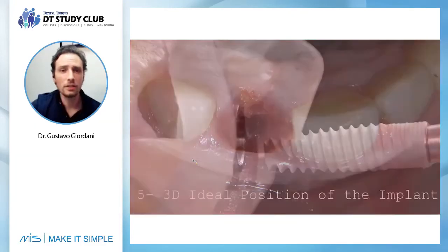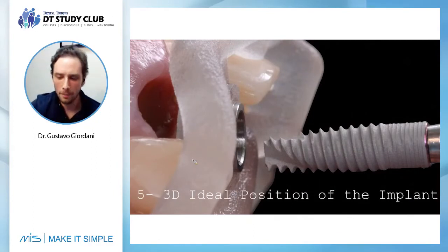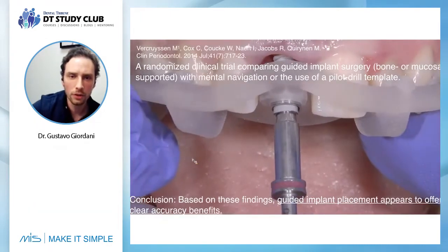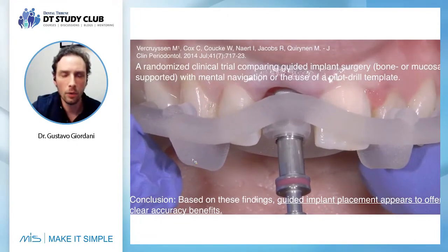By using this guide, we drill the implant in the correct position, and you also place the implant with the guide, because it's not correct to drill the implant position and then remove the guide to place the implant with a free hand.